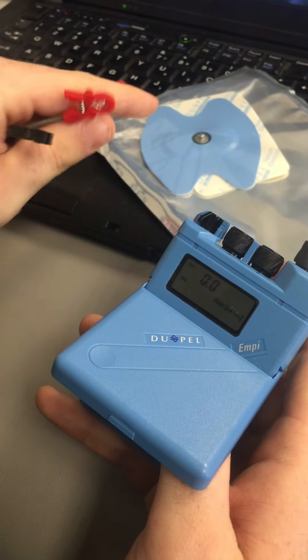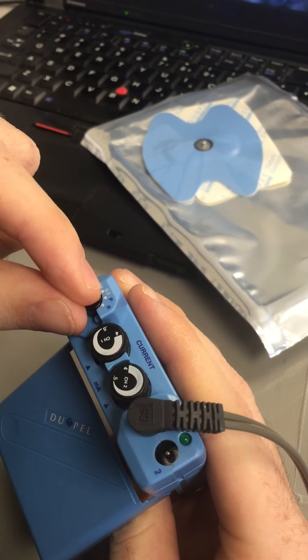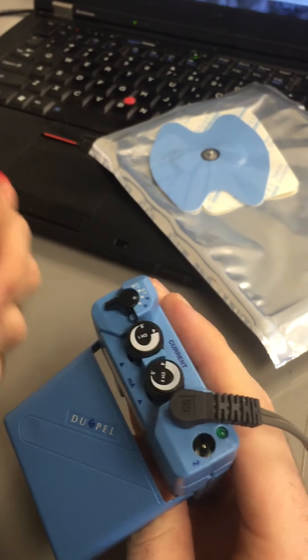Once all your parameters are set and the medication is on there with everything attached, you just flip this over to run, and that's going to start the treatment.